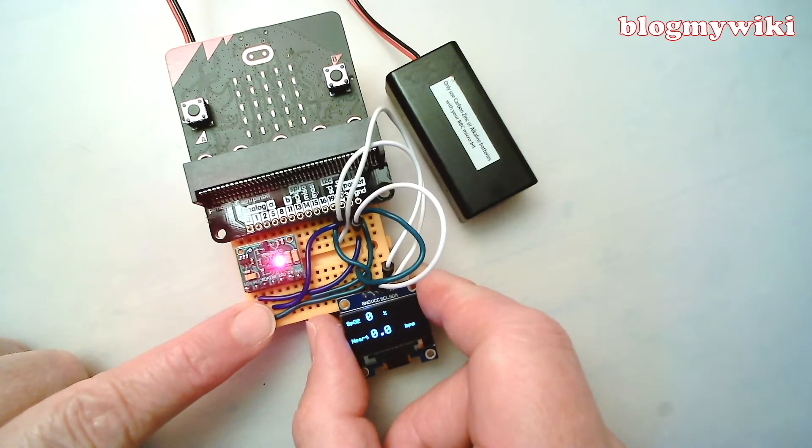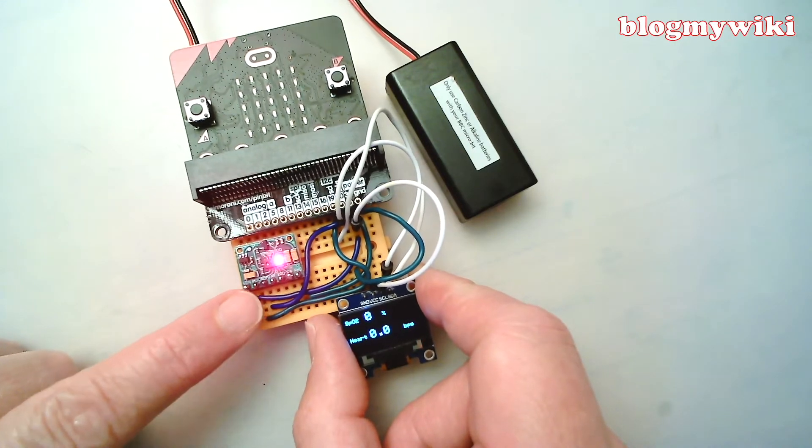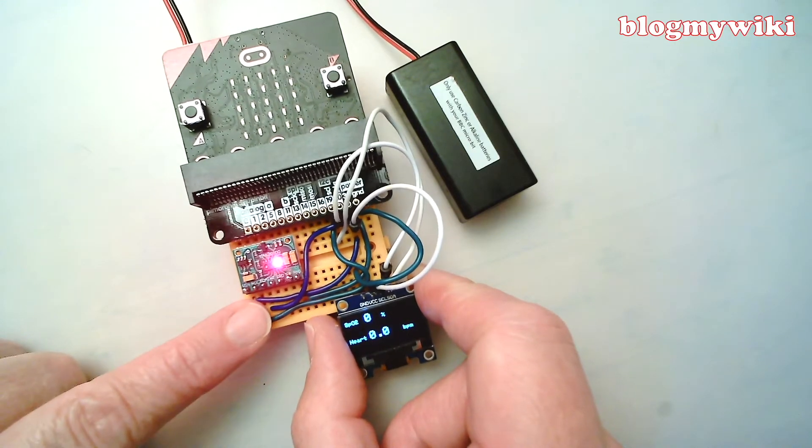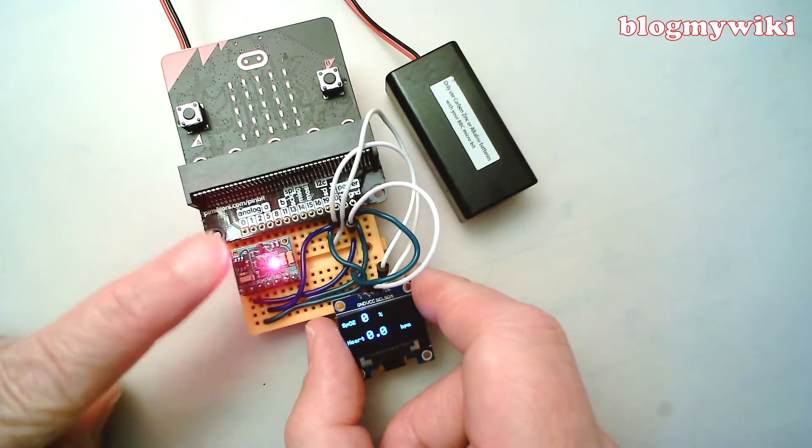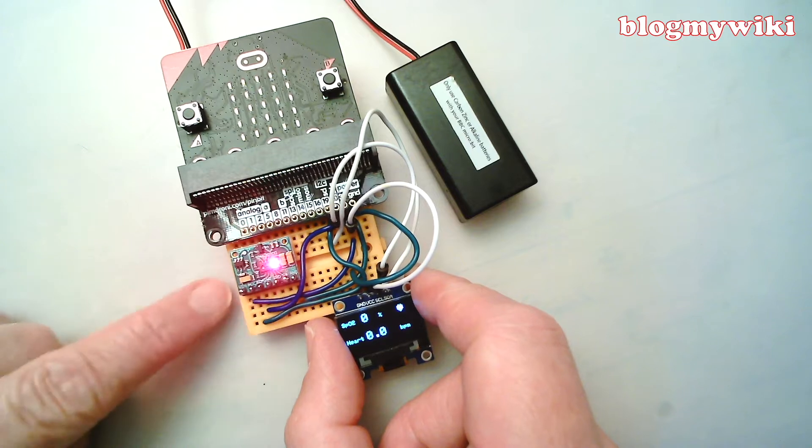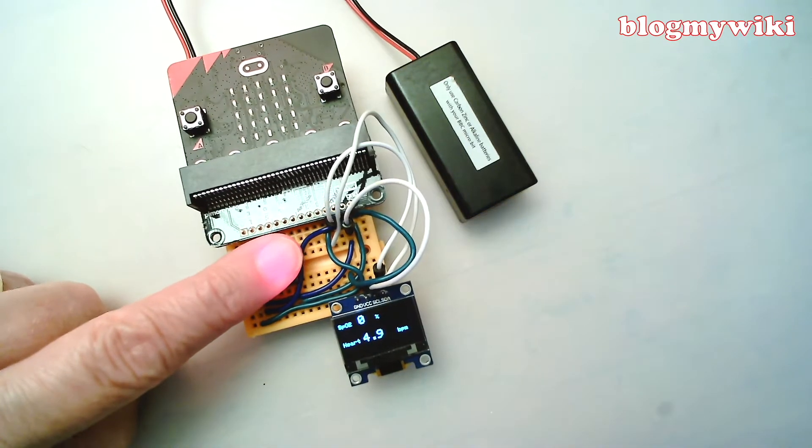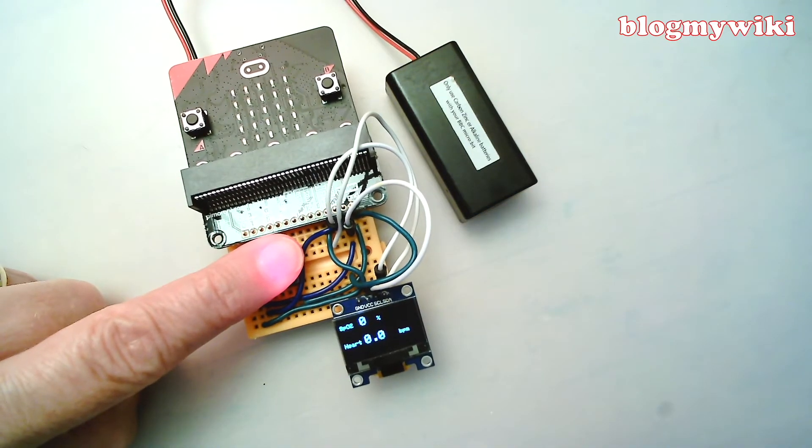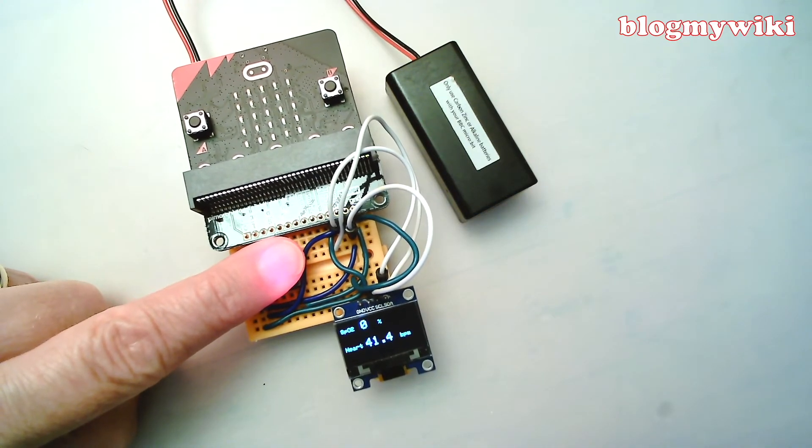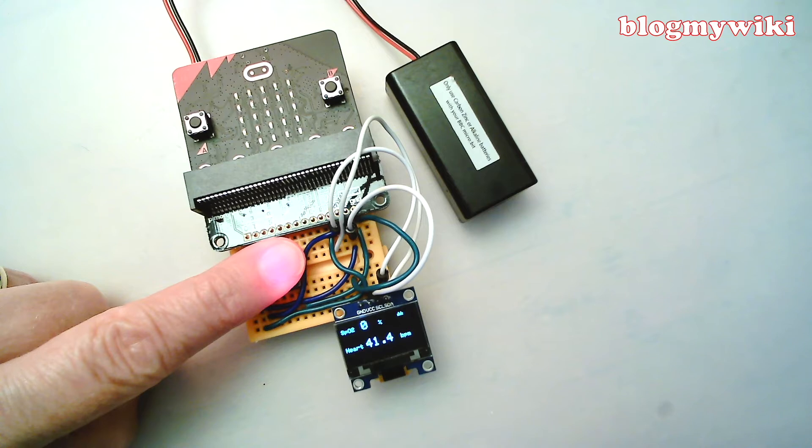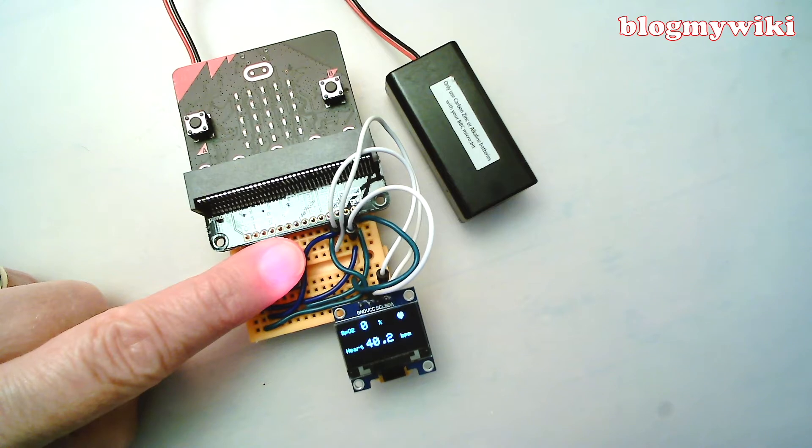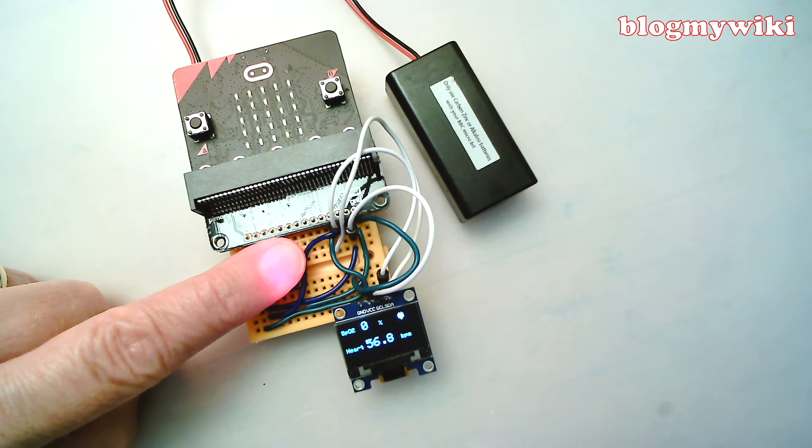And what happens is if you put your finger on the LED here, it should start measuring my blood oxygen level and my heartbeat. Every time you see the heart flash, it means it's detected a heartbeat.